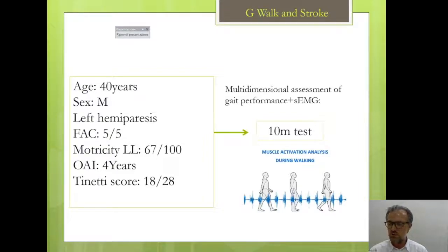Actually, nowadays, during the 10 meters test, or any other distance that you want to use to provide gait analysis with your patients, you can receive at the same time data coming from the EMG probes of the system.